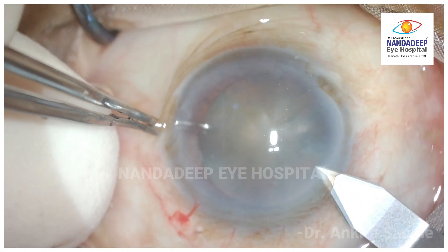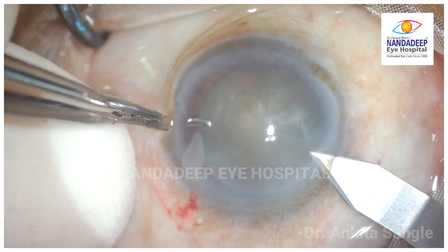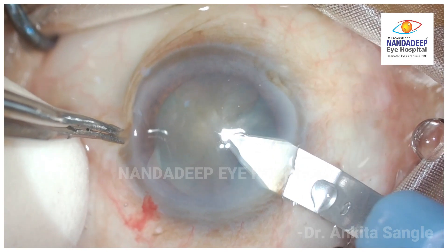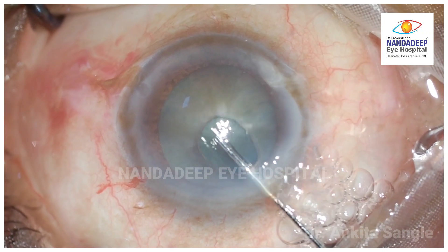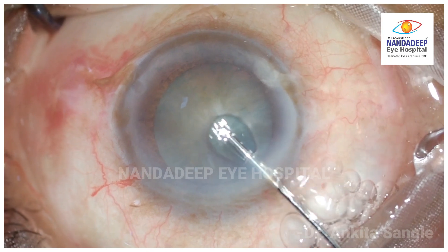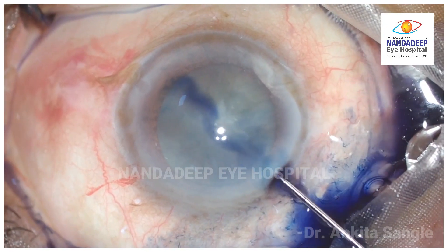Another interesting case — watch carefully at the incision site. Here, this amateur surgeon during a cataract surgery tries to stain the anterior capsule, not realizing that the dye is being injected into the substance of the cornea rather than the anterior chamber, causing the Desmet Membrane to detach.